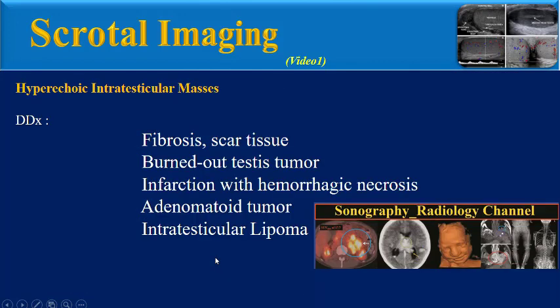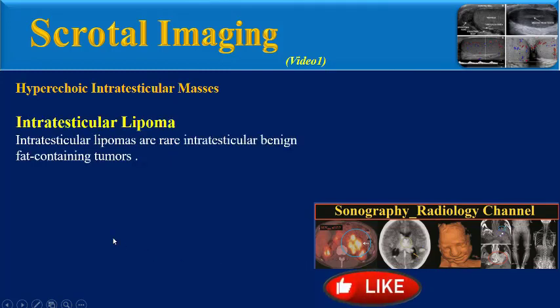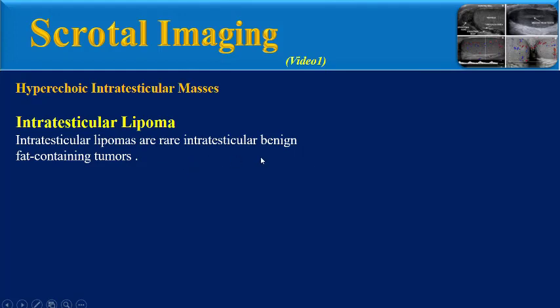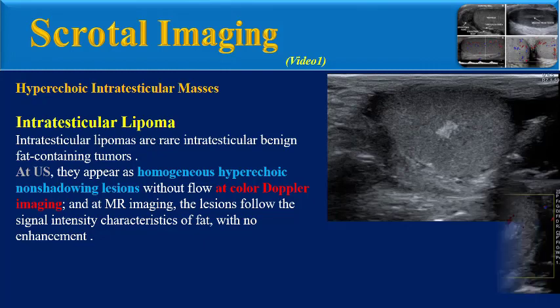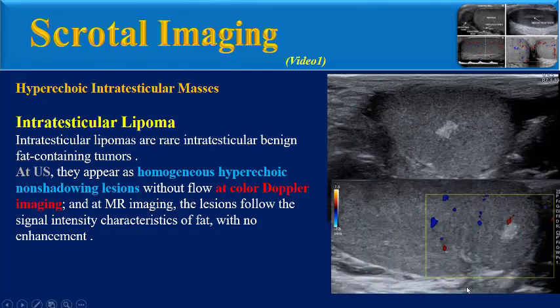The last entity is intratesticular lipoma. Intratesticular lipomas are rare intratesticular benign fat-containing tumors. At ultrasound, they appear as homogeneous hyperechoic non-shadowing lesions without any flow on color Doppler ultrasound. At MR imaging, the lesions follow the signal intensity characteristics of fat with no enhancement.